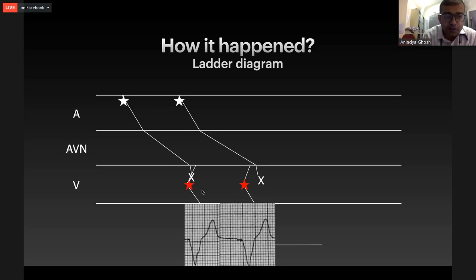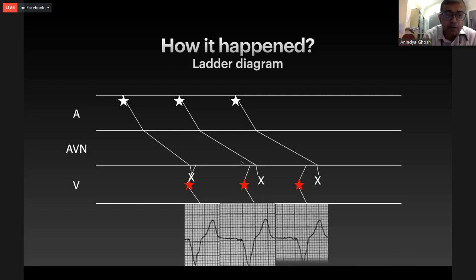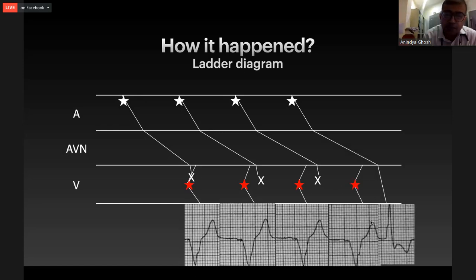But because the ventricle is pacing every time, leading to a QRS morphology which is also conducting somewhat retrogradely to the AV node, there is some refractoriness with each beat, which is leading to a Wenckebach. You can see the slope of the conduction on subsequent beats, which is decreasing. And there would come a time when the PR interval would be so prolonged that it would extend beyond the paced QRS morphology and lead to a capture of the ventricle, leading to a narrow QRS.